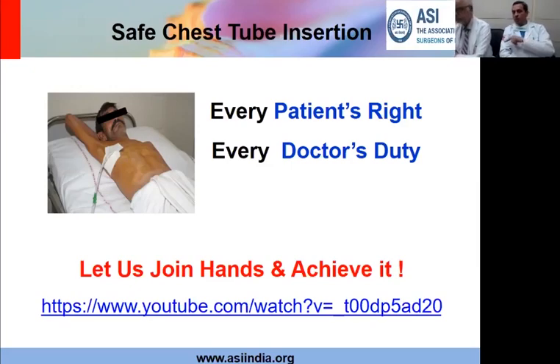So it's important that you enter and try to have your chest tube ideally placed: one which goes into the posterior recess and the tip lies just at the paravertebral gutter. If it's in the posterior recess, imagine the patient in sitting position, the entire fluid will drain down, go into that space and get drained from the chest tube. So it will give you the best possible egress for the fluid.